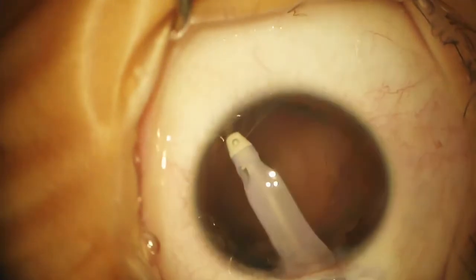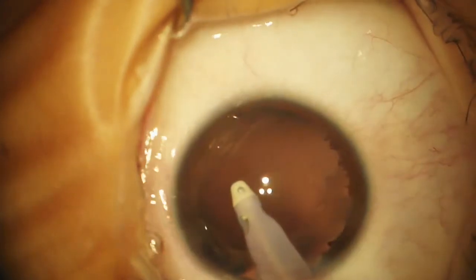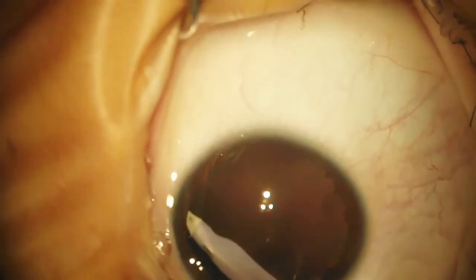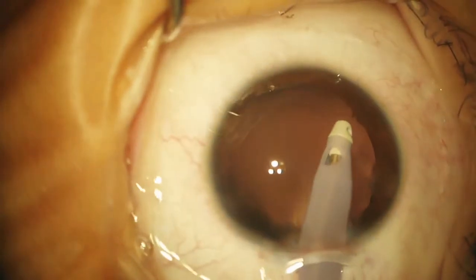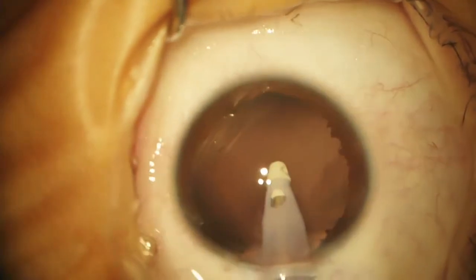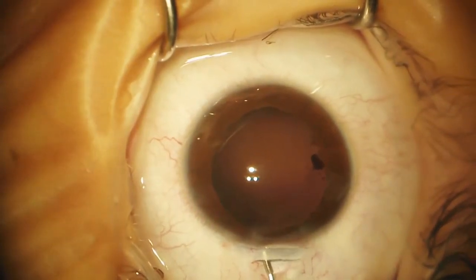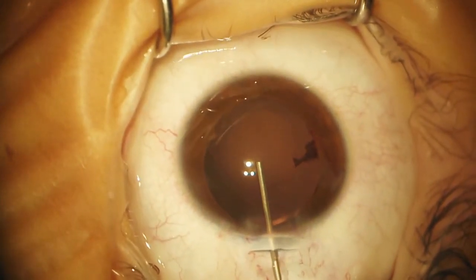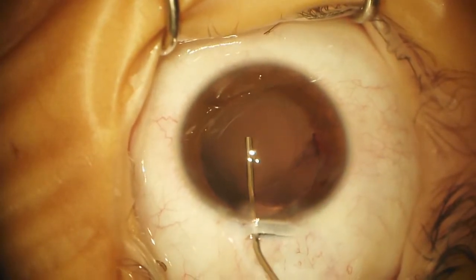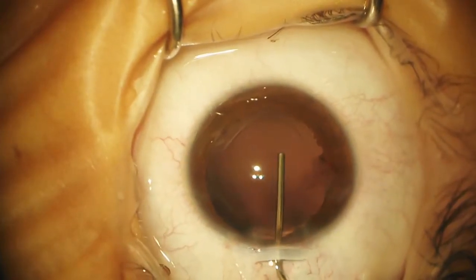I do like to get these lens epithelial cells in young children because I think it prevents some inflammation and decreases the chance of capsular phimosis. Children are very similar in their inflammatory response to conditions like pseudoexfoliation. When you put ProVisc in, you want to get the air out — just put it right at the wound so that you don't catch the iris. You can see there's a little bleeding off to the right there.